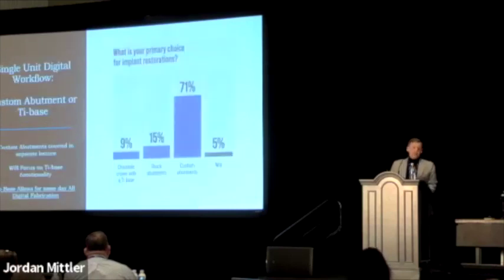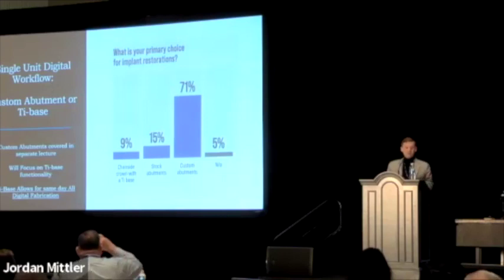All right, so now you have your implant in your CAD program. You have the implant position and the hex position. Okay, what are our designs? So I was under the impression there was going to be a lecture on custom abutments, but this is fine because I really wanted to focus on Ti bases either way.